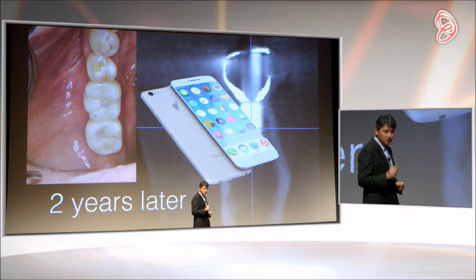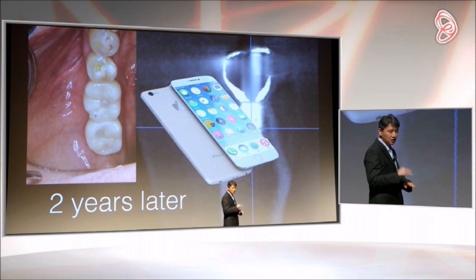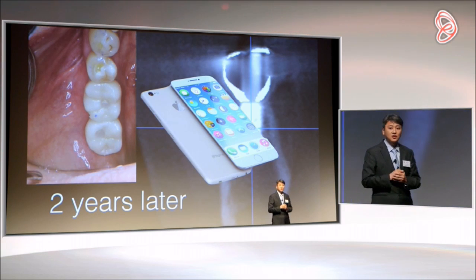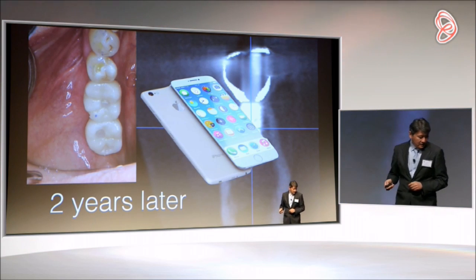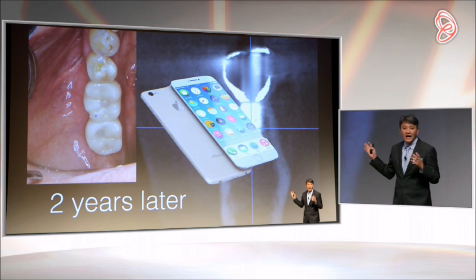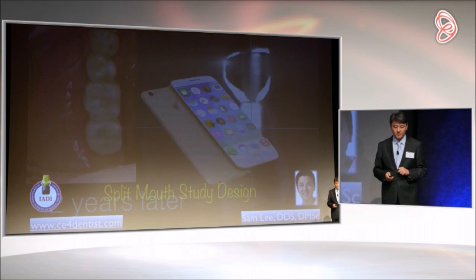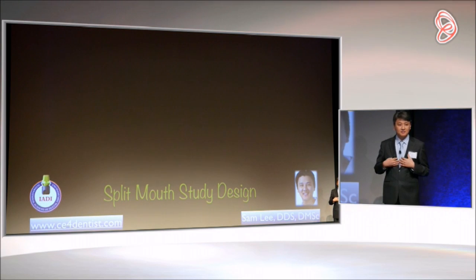Right now, horizontal growth only. If you want to do vertical growth, you would have to use sponge bone using tunneling technique. So this is truly the iPhone 7 of implant dentistry. I feel like I'm Steve Jobs.